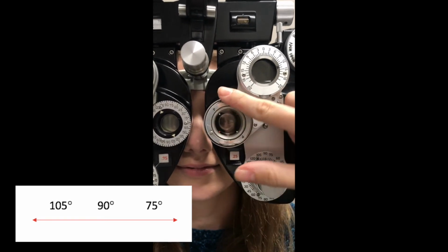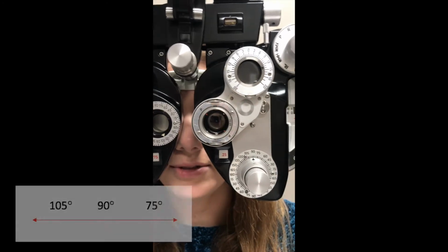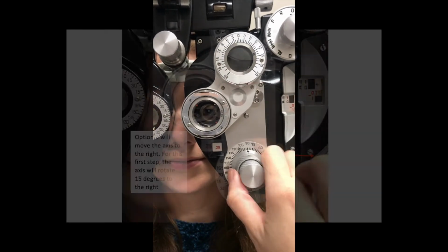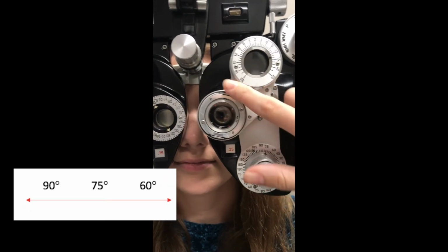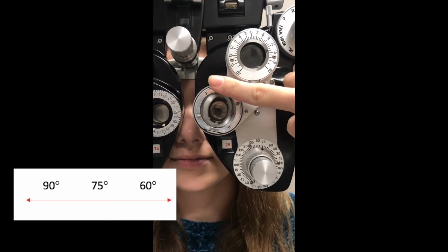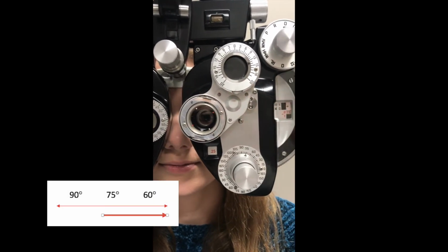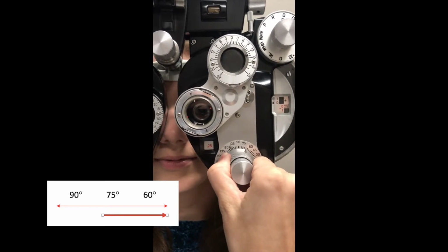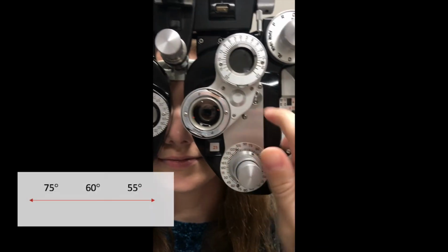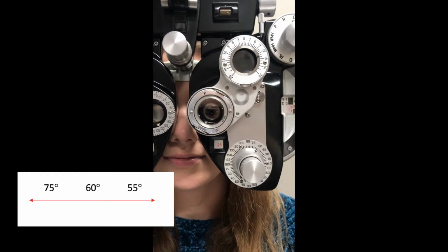So option 1, Abigail, or option 2? Option 1. Option 1, so she wants to move it to the right. Here we go. Let's try this now. Okay, Abigail, option 1 or option 2? Option 2. Option 2. Once again, the red dot's going to the right, so we will move 15 more degrees to 60 here. Okay, Abigail, option 1 or option 2?